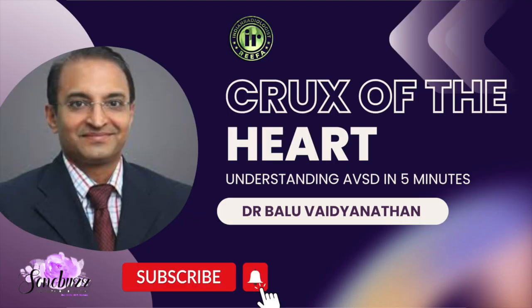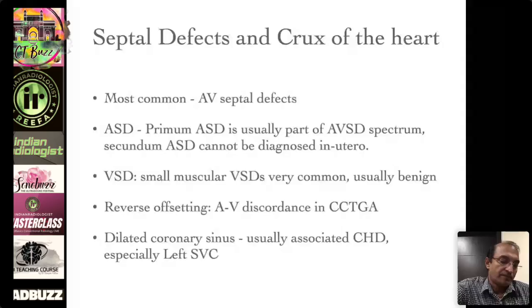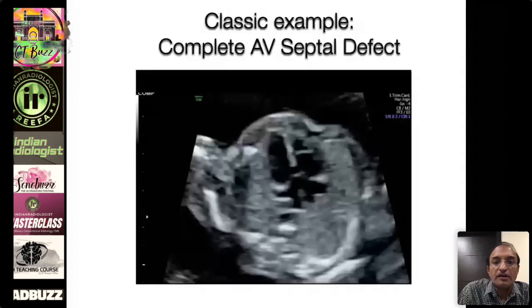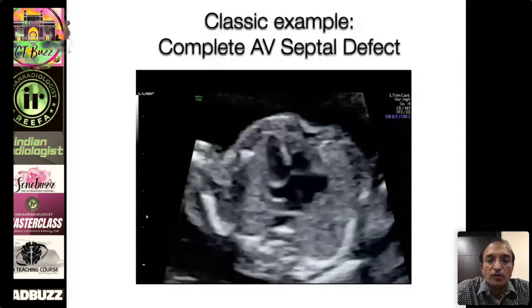The final group in the four-chamber view is the septal defects and the crux of the heart. I'm mostly going to focus on the AV septal defect, and I will also show you CCTGA four-chamber view because it deceptively looks very normal. This is an example of a complete AV septal defect — when you look at the center portion of the heart, you can make out the defect.